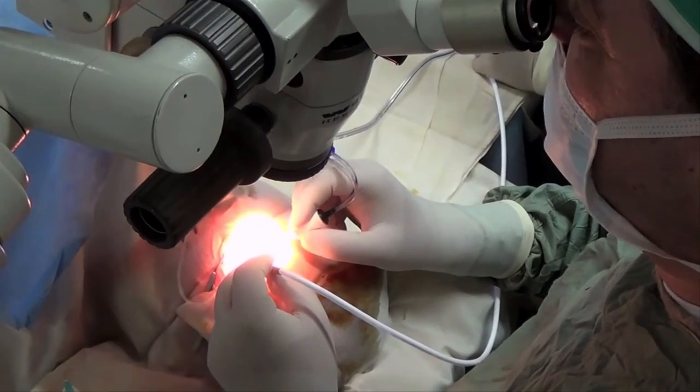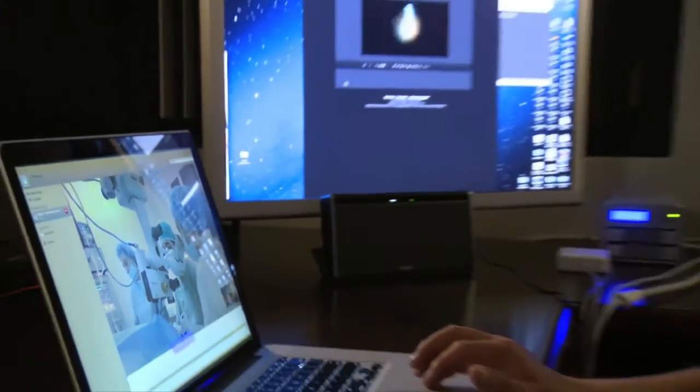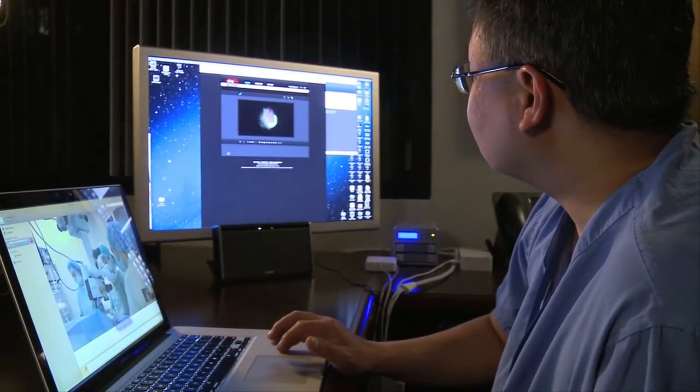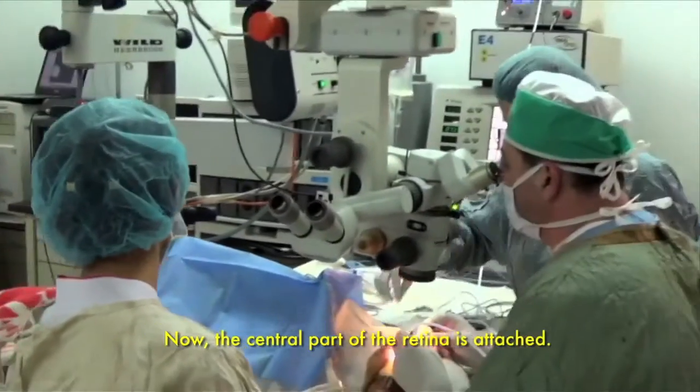She may regain some degree of vision. It looks like it's already attaching, so that's good. Now the central part of the retina is attached.